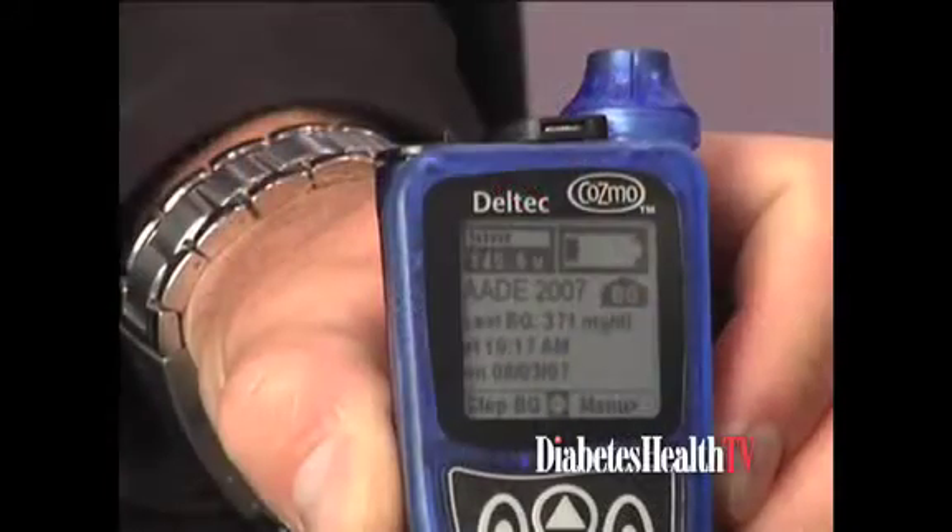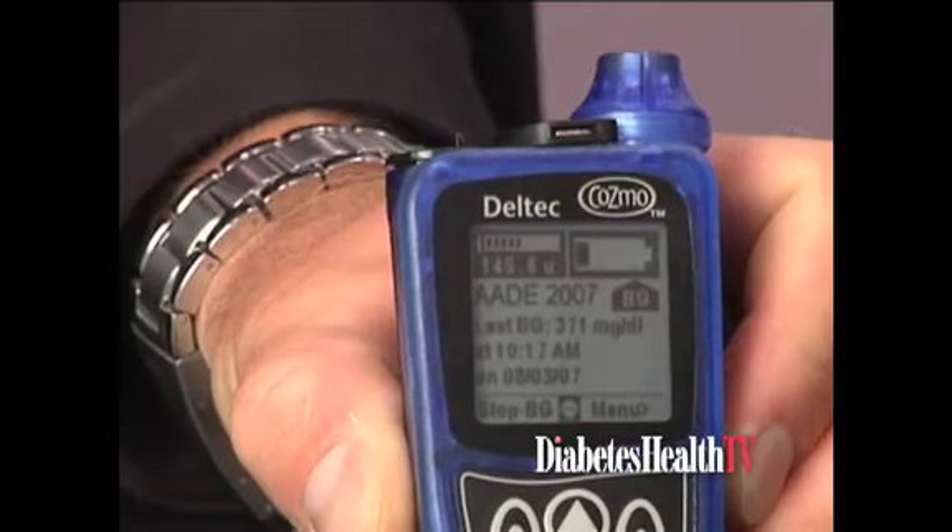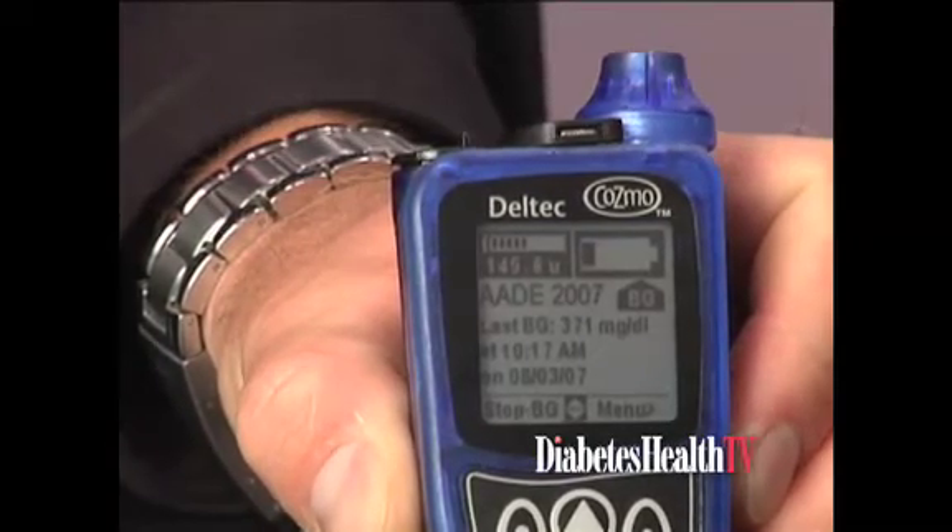Tell us about your pump and what makes it different from the rest. Our pump is actually new as of December of last year — it just gained FDA approval back in December. It has 14 new features in comparison to our prior model, the 1700. Now we've come out with the model 1800, with features more specific to patients and their needs to create much better outcomes.